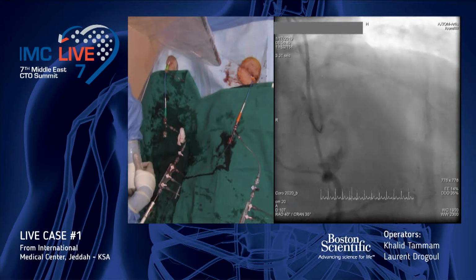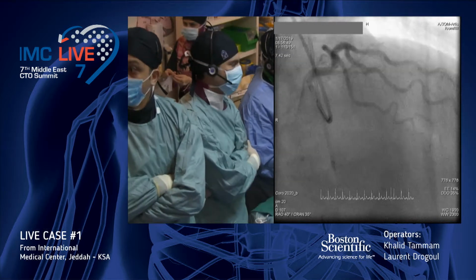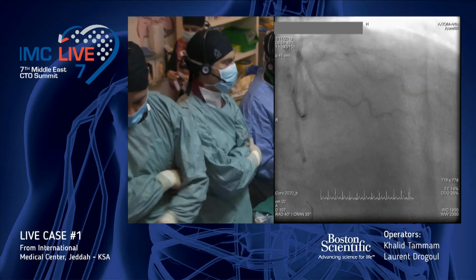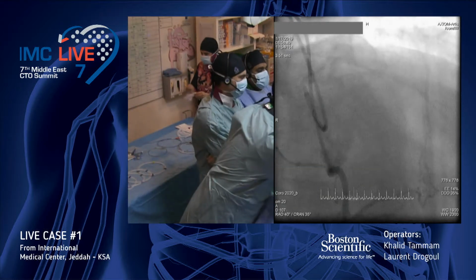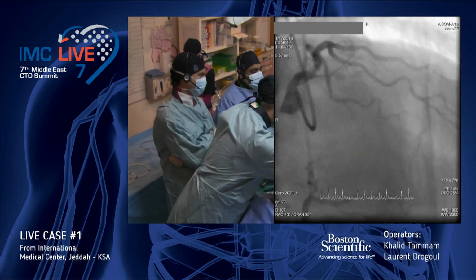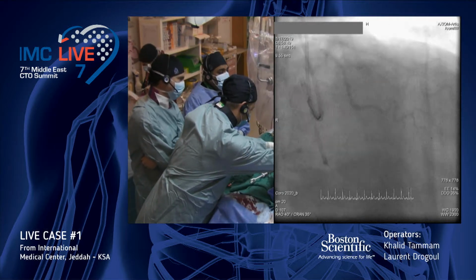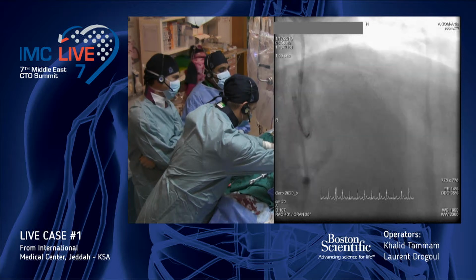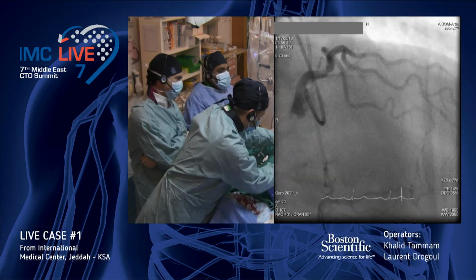We agreed it was more significant in the diagnostic angio, and now it's a little bit regressing, but we decided to treat the circumflex before starting. You can see that it has good retrograde as well as antegrade flow, with a heavily calcified lesion in the LAD. Next, please.